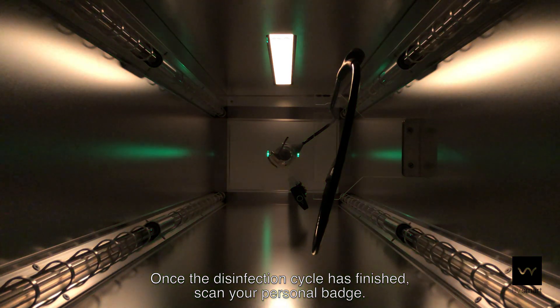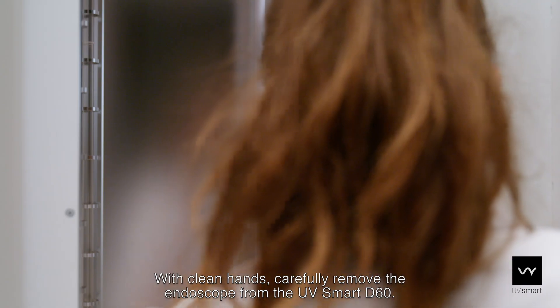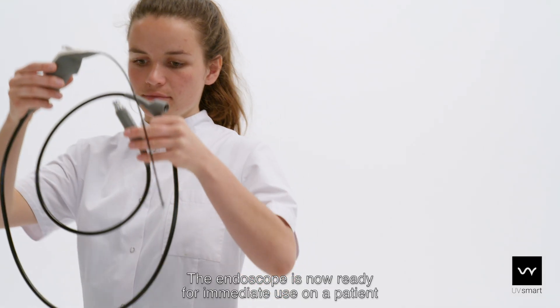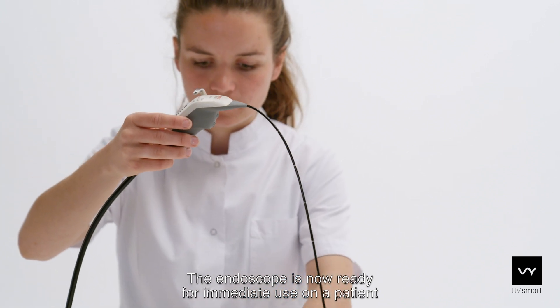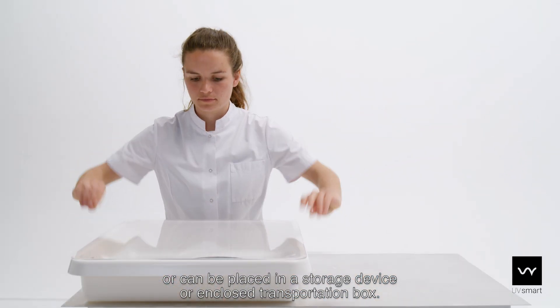Once the disinfection cycle has finished, scan your personal badge. With clean hands, carefully remove the endoscope from the UV Smart D60. The endoscope is now ready for immediate use on a patient or can be placed in a storage device or enclosed transportation box.